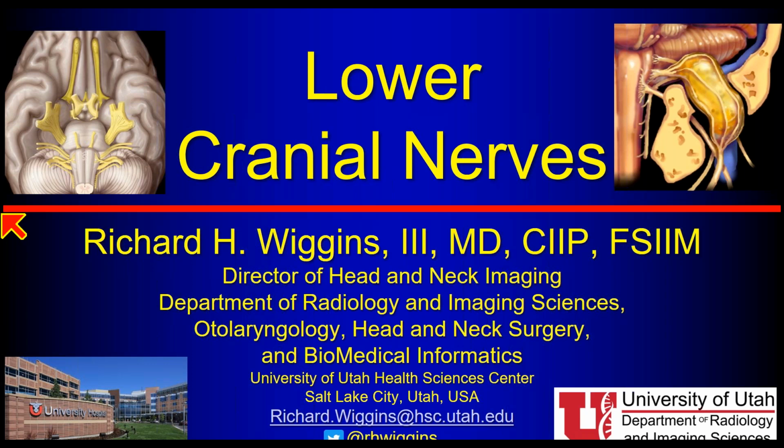When we think about the skull base and the extracranial head and neck, where there is air and where there is fat is very important. So we want to do an axial and a coronal T1 through the skull base. I do either an axial T2 FSE with fat saturation and a coronal STIR, or you can switch those, whichever is better on your scanner. And then I do a thin post-contrasted axial and coronal T1 with fat saturation. We want to get pretty thin images there, so maybe a 3-skip-0 or a 4-skip-1, depending on your scanner and your vendor. But we want to look at that area very closely.